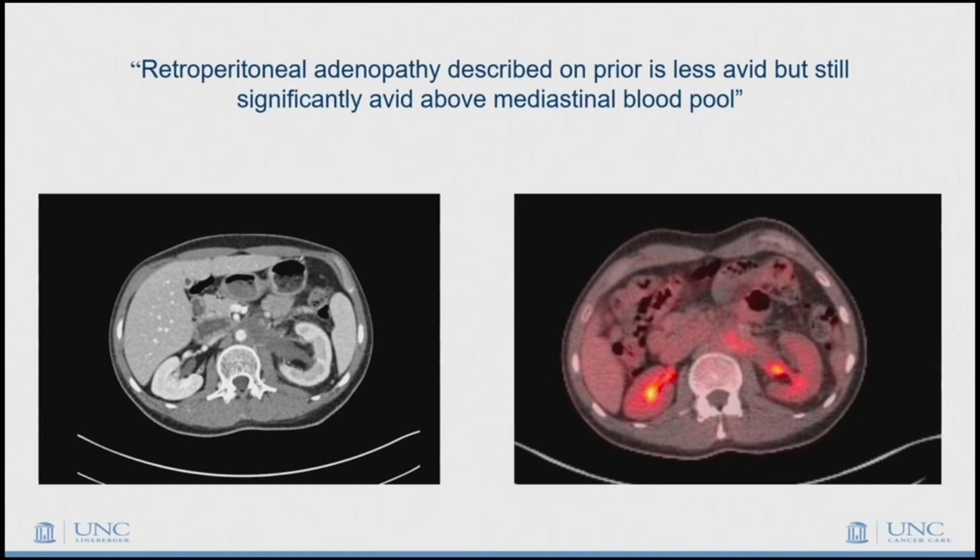And this is not to, I know I'm sitting next to a radiology colleague here, but it's actually very hard. There's these algorithms that say positive and negative in them, but when you're actually sitting in a tumor board for a seminoma patient after chemotherapy, they don't really say positive or negative. They say things like, it's less avid, but still avid above mediastinal blood pool. And you're sitting there saying, well, is that positive or negative? I need to know. And they say, well, we can't really say those words, right? And so there's all these sort of equivocal reads on PETs after chemotherapy.